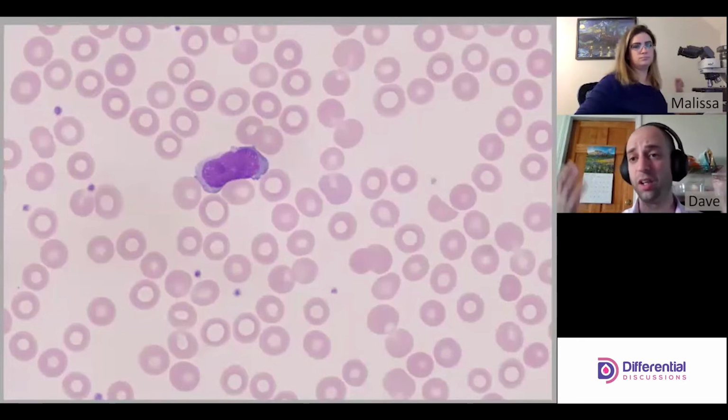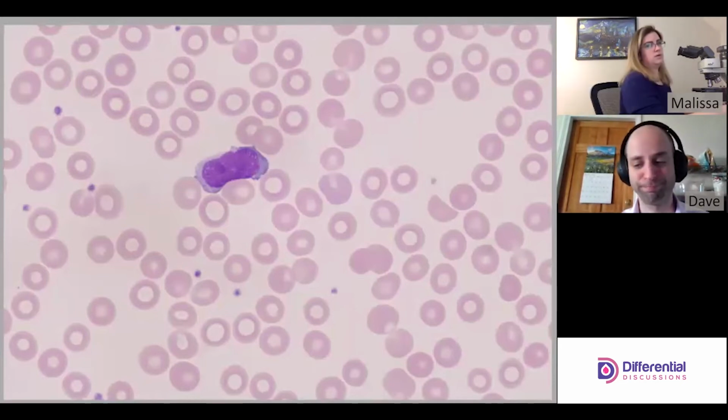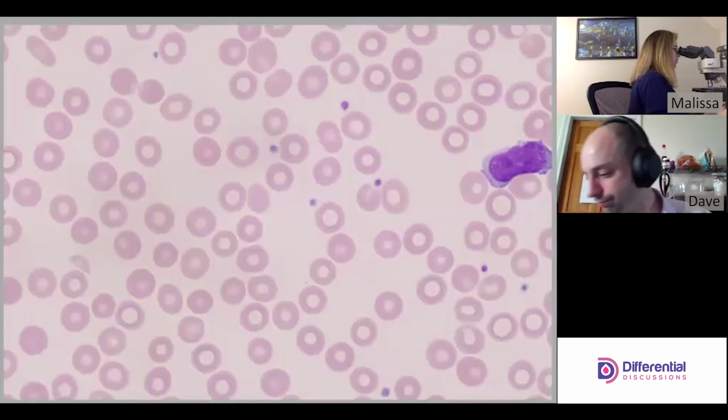They don't. Also, I opened looking at a lymph and commenting on nuclear to cytoplasm ratio. This is a heavy nucleus to cytoplasm ratio. Yeah, also owing itself to being a lymph. Very true. All right, lymph then. Let's see if we can find a mono or something else.